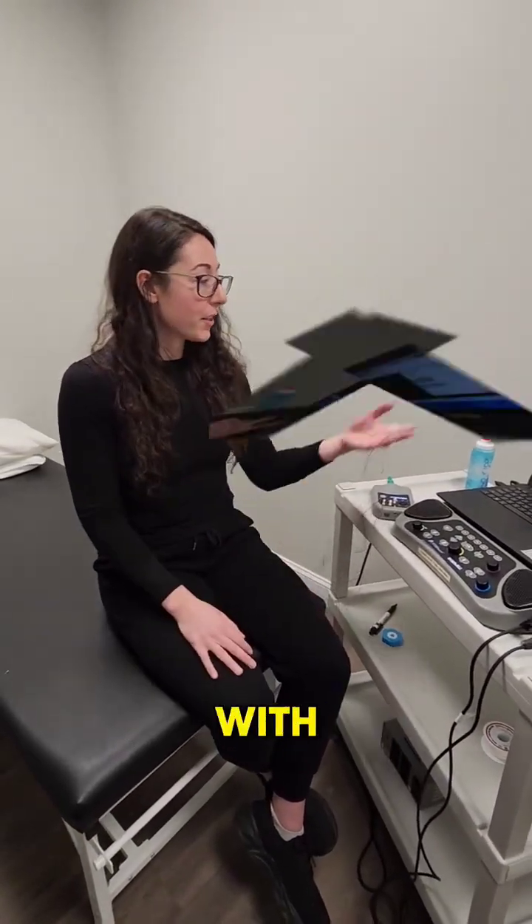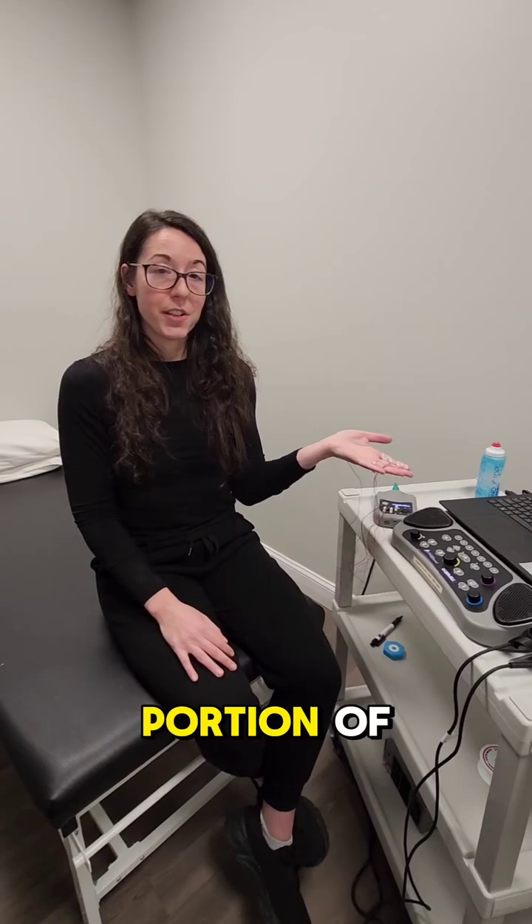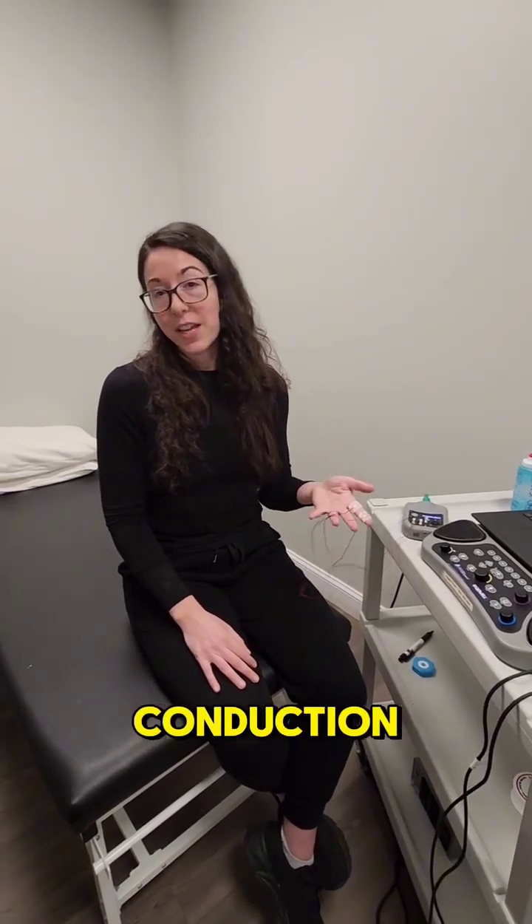Hey guys, Dr. Manzi here. Regarding the last video that we just did with our beautiful waveform here, I just wanted to clarify. So this is the NCV portion of the test — that's the nerve conduction velocity portion.